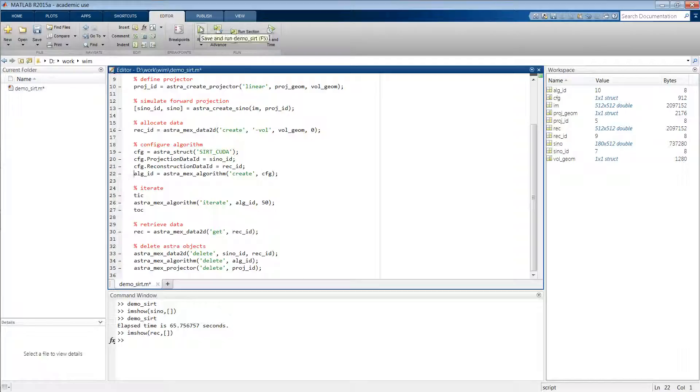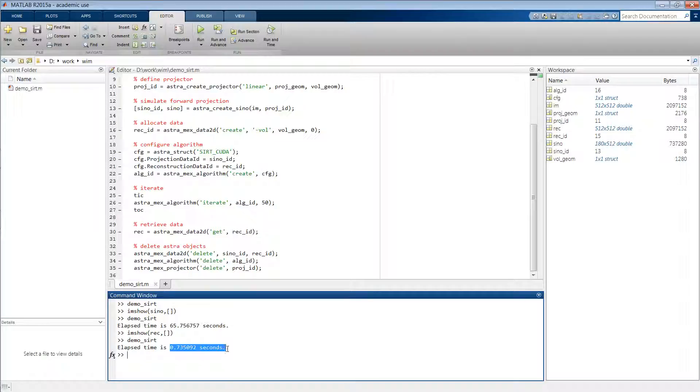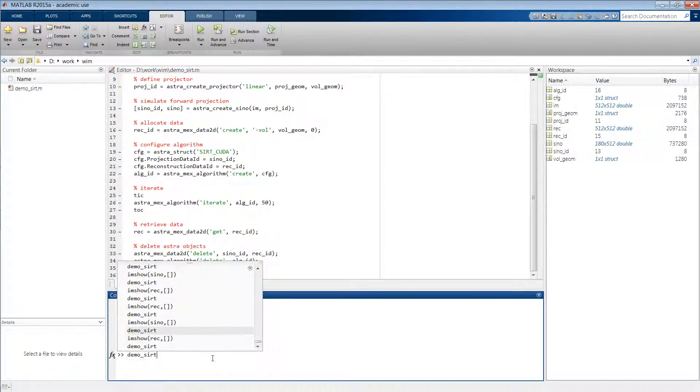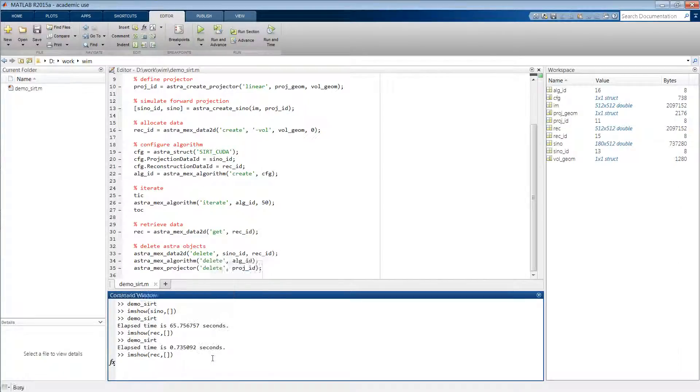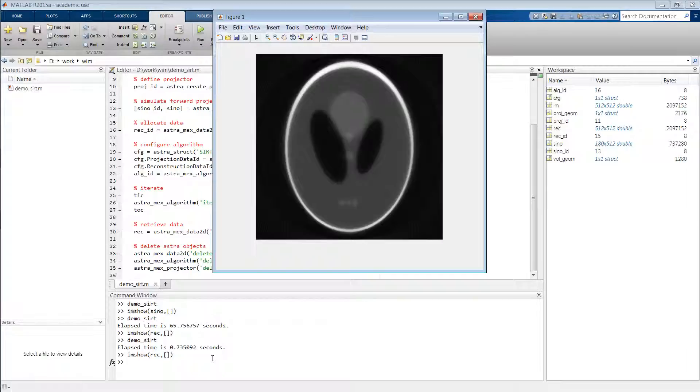So if we now run it again, you see that it took us less than one second to do these 50 SIRT iterations. And if we look at the result, we indeed see the same reconstruction appear.